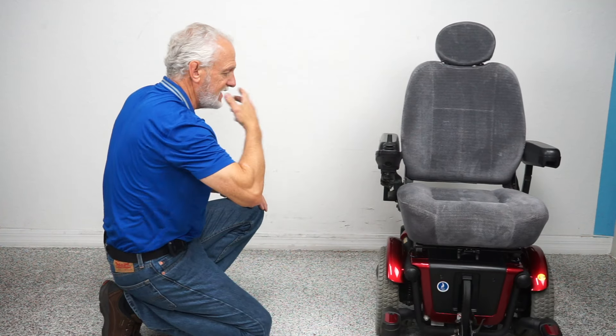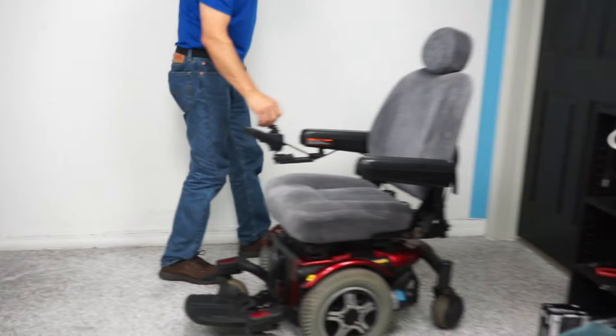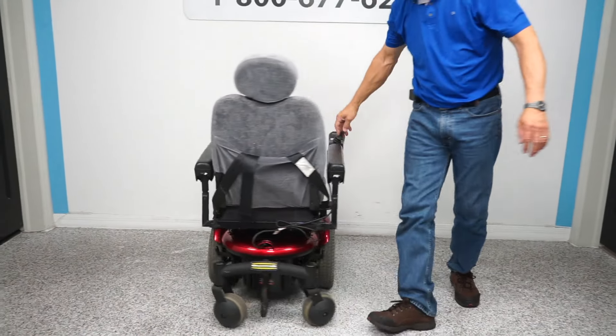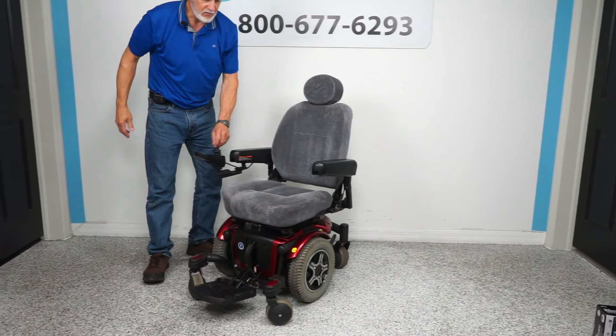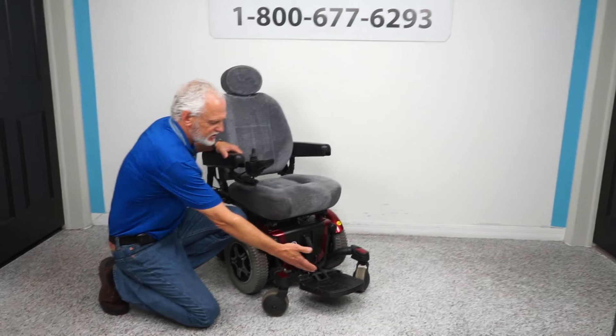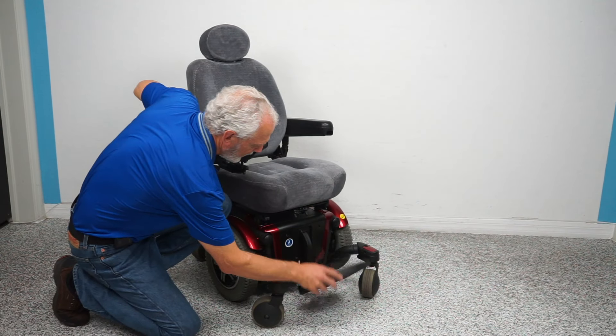The nice thing about this chair is that it has a really good turning radius. If you go over here you'll see how it turns on its own length — look at that. So whatever the length of the chair is, it'll turn within its own length.